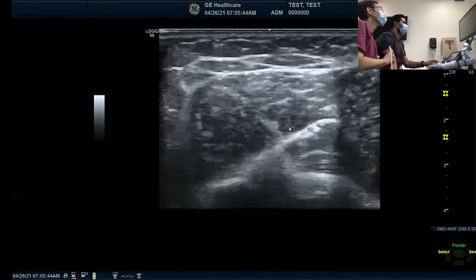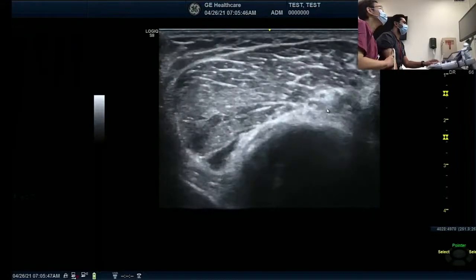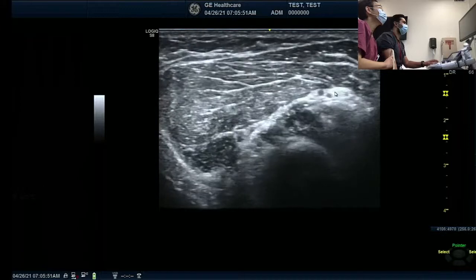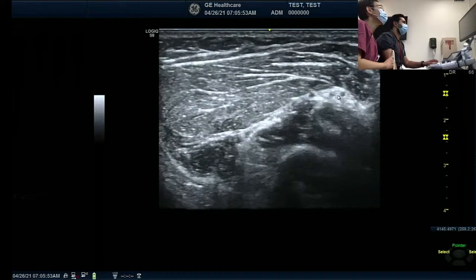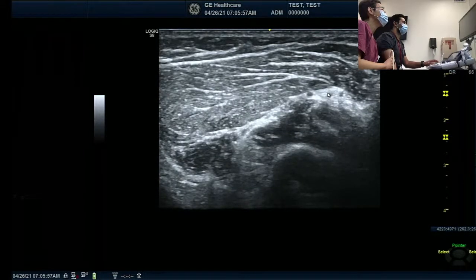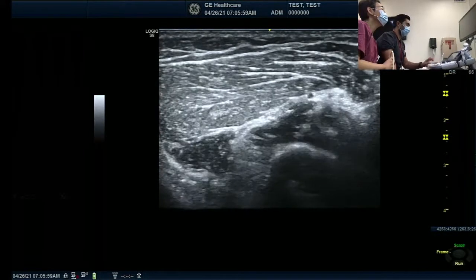Okay, we have to go downstairs now. Superficial, proximal one, follow the proximal one. So now look at this superficial one here. That one is in between brachialis and extensor carpi radialis. Can you freeze here? Okay.